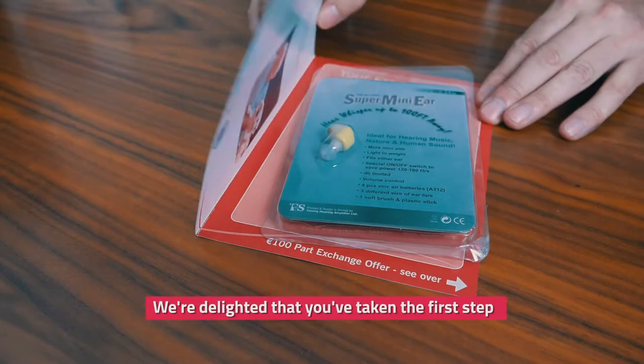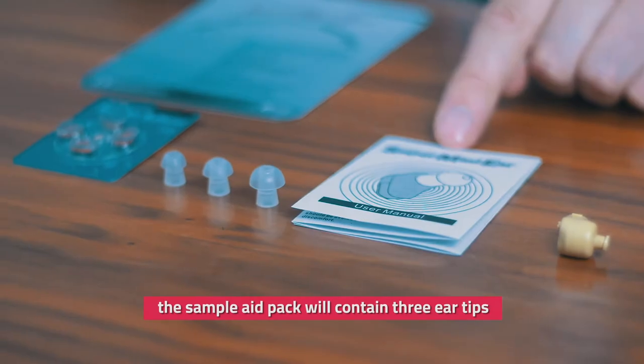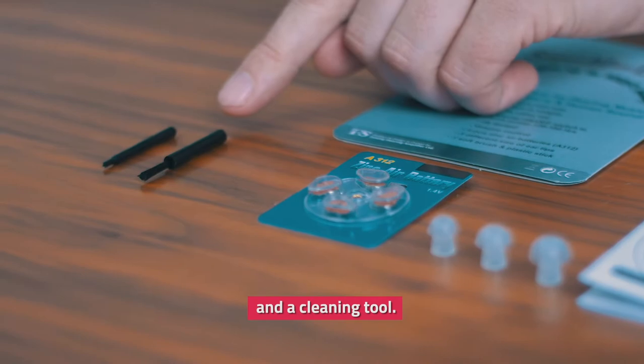We're delighted that you've taken the first step to improve on your hearing. This sample aid will allow you to experience amplified sound. The sample aid pack will contain three ear tips, a pack of four batteries, and a cleaning tool.